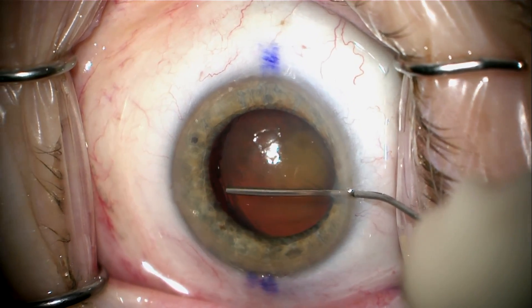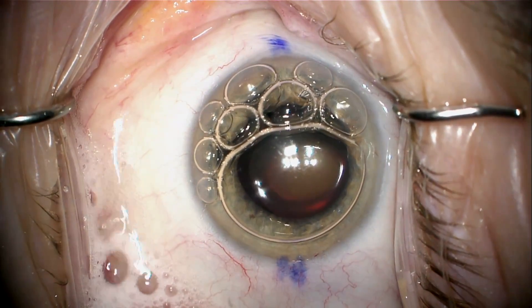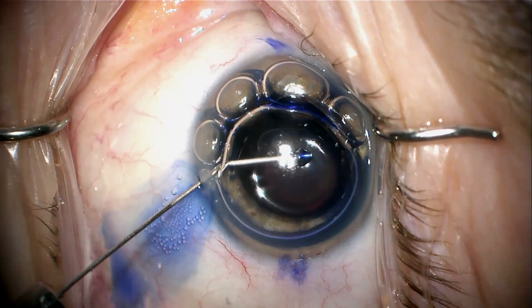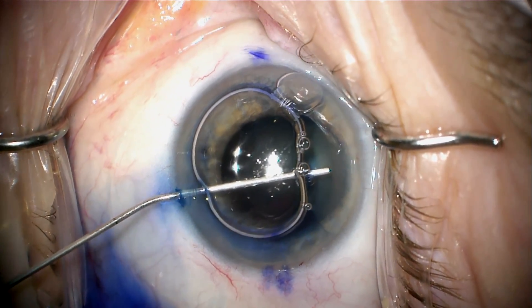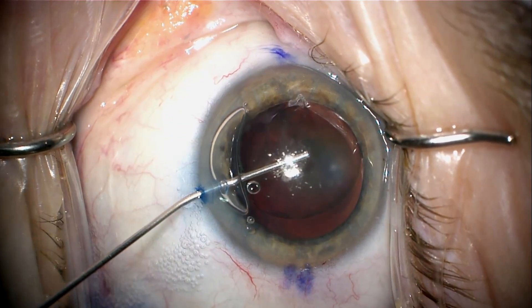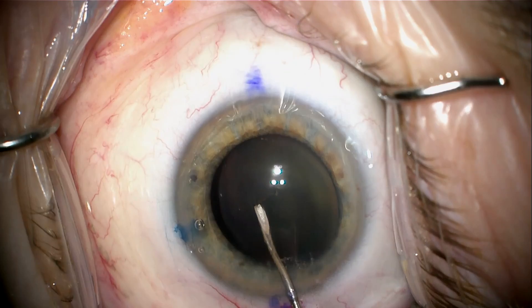There's some phacodonesis. Here I'm putting viscoelastic in that gap so that when I stain with Vision Blue, the Vision Blue doesn't run posteriorly — it'll act as a barrier and block that off. So here I'm staining with Vision Blue, which will help me see the edge of the capsulorhexis throughout the case. I'm displacing that with viscoelastic and I'm going to start my capsulorhexis.